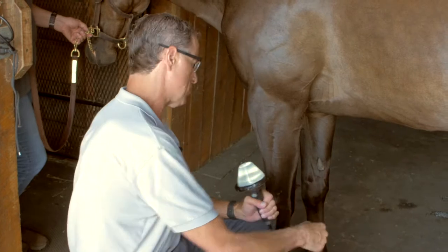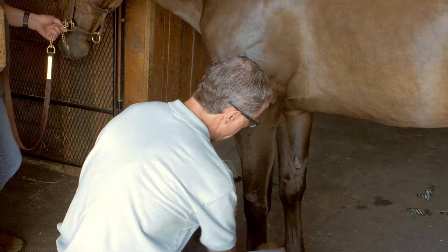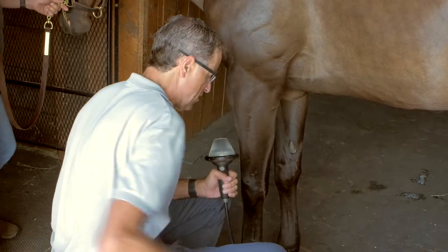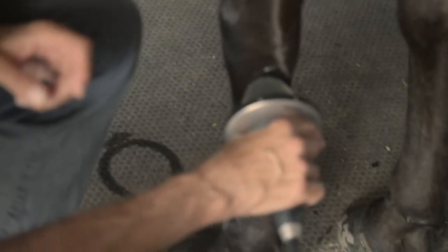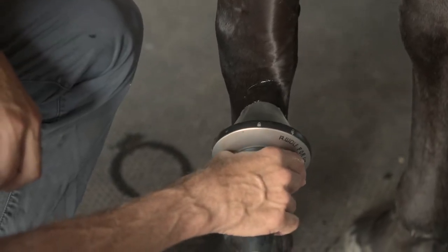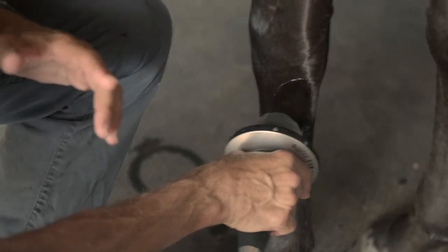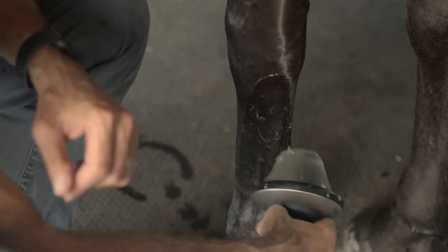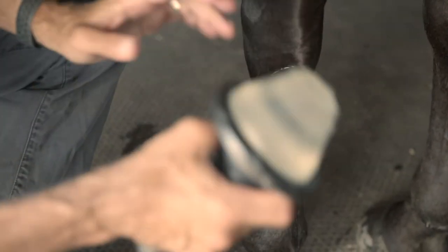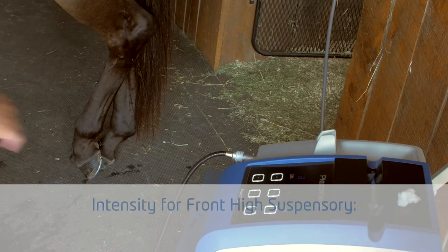I'm going to treat from the outside, from the lateral aspect today, but there's no reason why you can't treat from both sides. Up here where it originates, we get a nice contact. As we migrate down, sometimes I'll lose contact and have to press a little bit harder to conform the probe to the skin surface — that's not a big deal. I split the treatment up between standing and flexed.